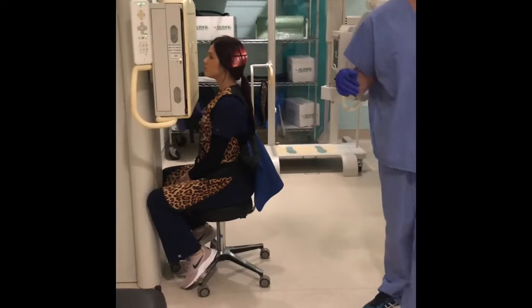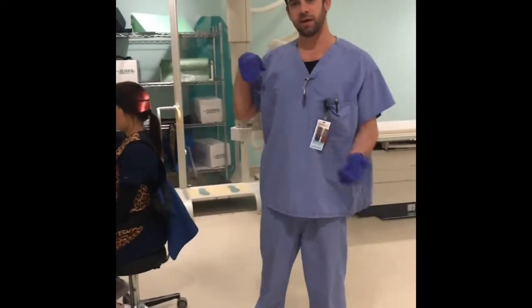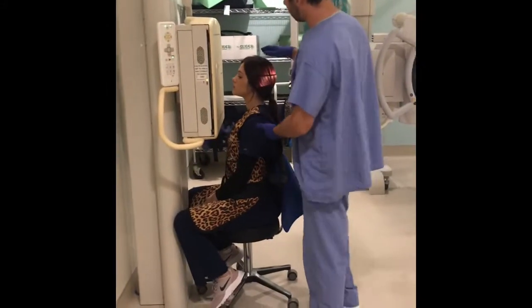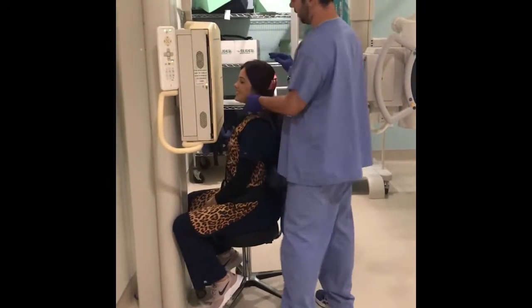So this is a parietal acanthial projection, which means it goes in through the parietals, exits the acanthion. And for this one, are you relaxed? You okay? Mm-hmm. Sorry, this is a little bit tiring.